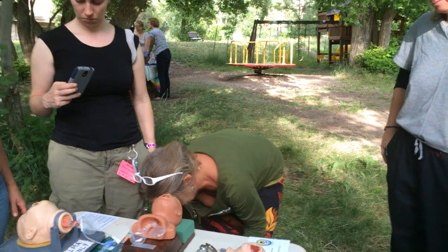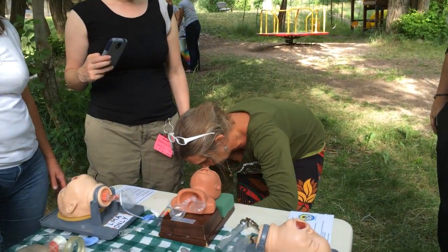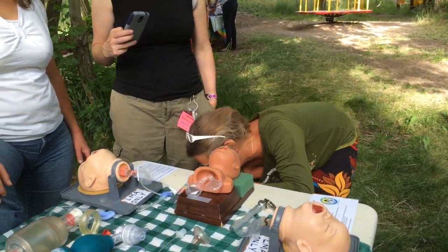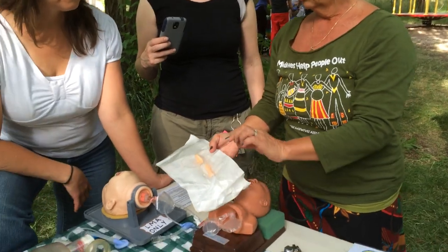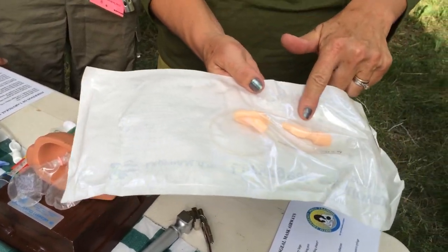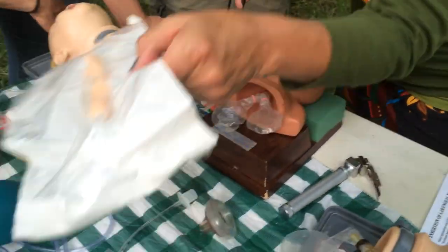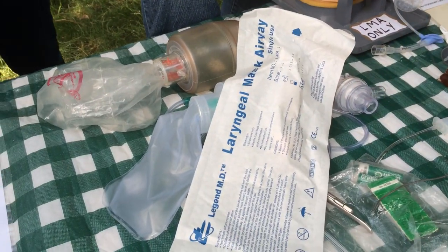Now I'm going to show you. Full of air. Can you send me that? That's video how they look. They come full of air. You can see that when they're full here, they're full here. Okay? So, this is an LMA. This is how it's packaged.